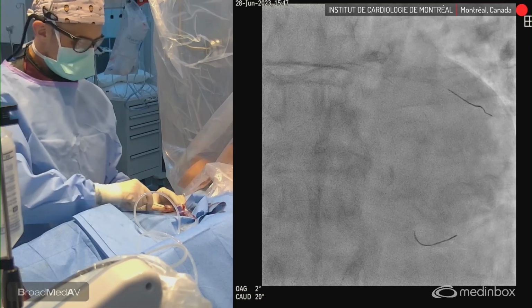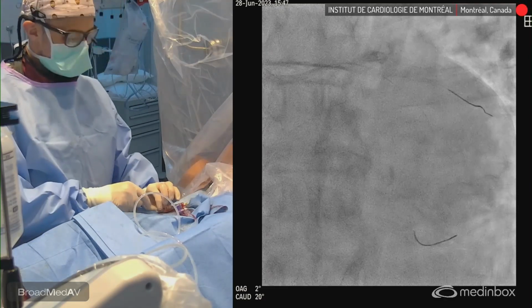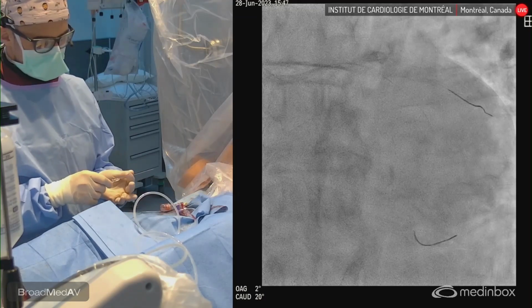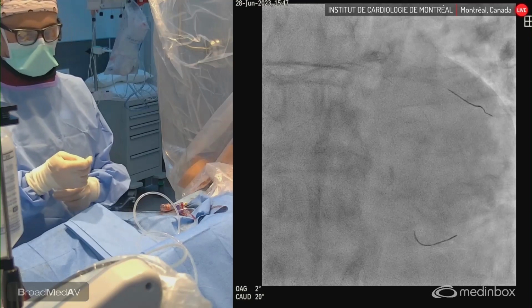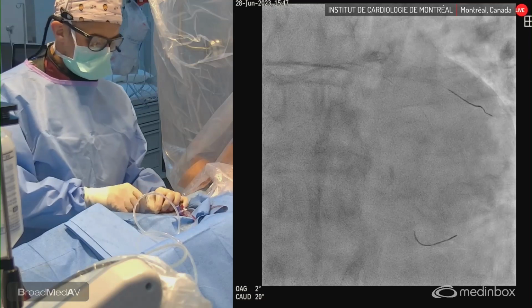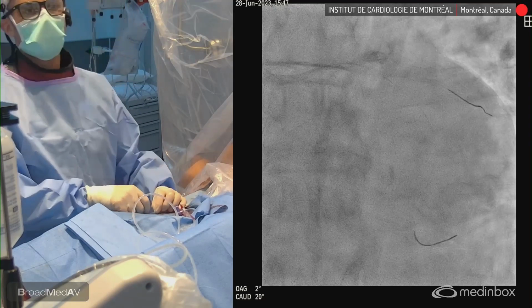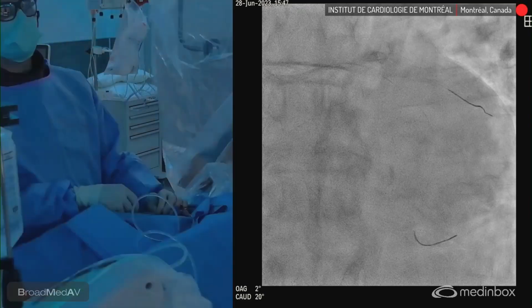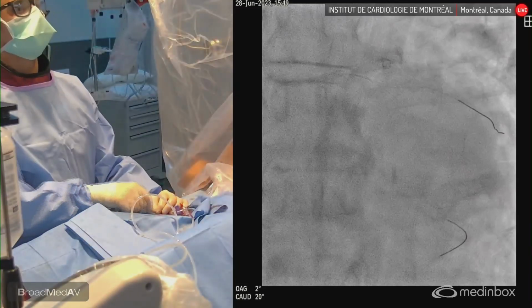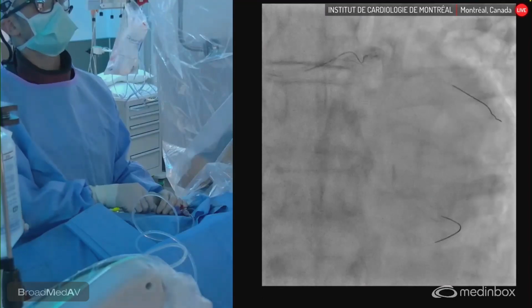I don't know how much stent you're going to have in the left main, Robert. No, but we can always go in order, you know. Okay, but maybe a 5.0. Yeah, just put that aside. So I'm already preparing for the kissing 2.5 balloons, just to open the struts. And then for the POT, we would use a 5.0 balloon. In this case, we're probably going to need to kiss and open the struts, both for the marginal and the LAD.